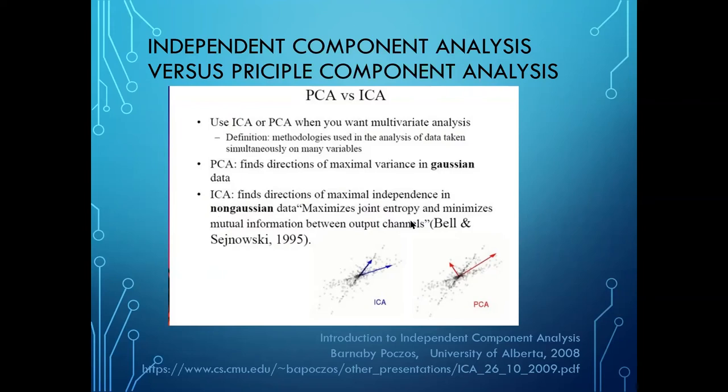Now, built into WinEEG is also Infomax. If you're looking for the source of components, you do an Infomax for identifying spectral components. And that's a much better software package than Fast ICA. Fast ICA is used for de-artifacting of major components of eye movement because it's fast, not because it's the best one, but it's quick. It's a quick and easy way to take some of them out. Infomax would be a little bit more stable. It does everything in parallel, maximally separating each of the spatial and temporal patterns so that you get maximal independence.